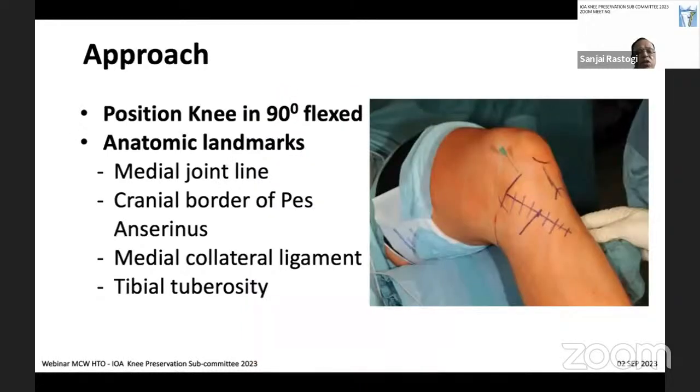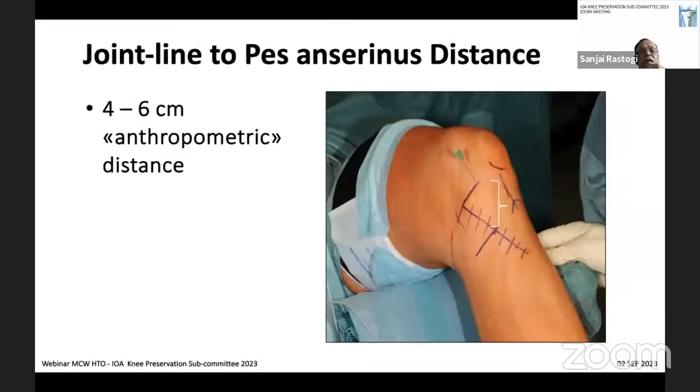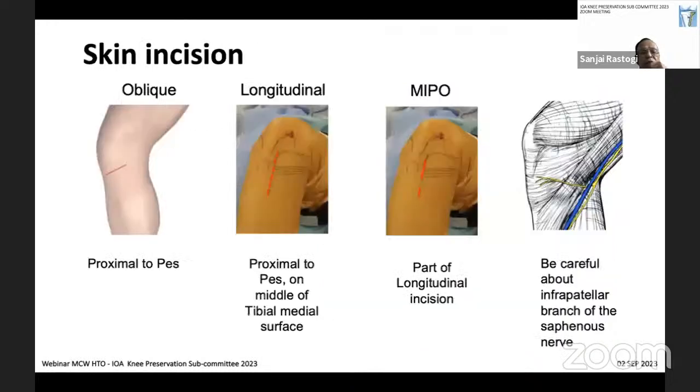The patient's landmarks are marked with the knee in 90 degree flexion: the medial joint line, the cranial border of the pes, the medial collateral and the tibial tuberosity. It has been shown by anthropometric distance that the pes insertion is at a distance of 4 to 6 centimeters from the joint line. So this gives enough area to put the proximal part of the plate.